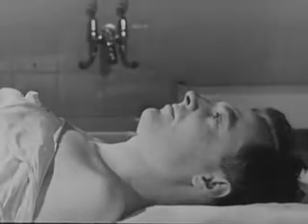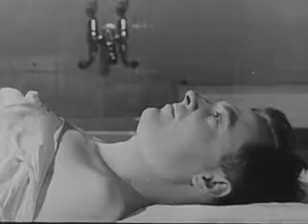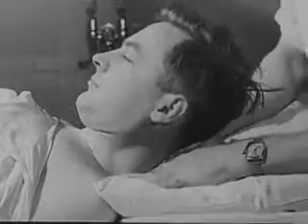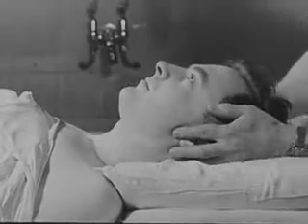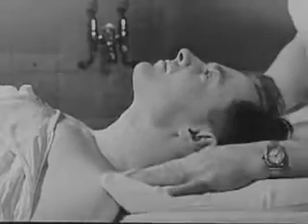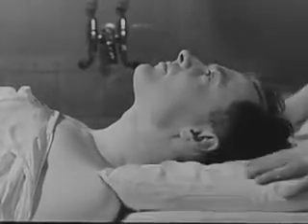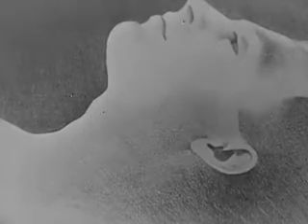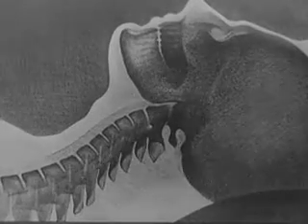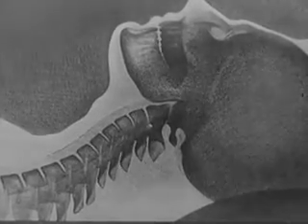The correct position of the head is the same for oral and nasal intubation. A pillow is placed below the occiput. In this way, the patient assumes the position of a man sniffing the air. These diagrams show the position of the head more clearly. The head is slightly extended on the atlas with the cervical vertebrae in normal relationship to the dorsal vertebrae.